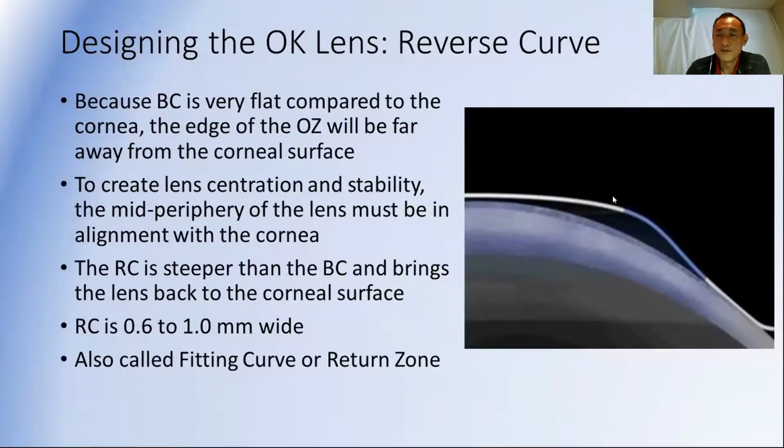The reverse curve is designed to bring the edge of the back surface back towards the cornea. So it depends on how flat that base curve is.